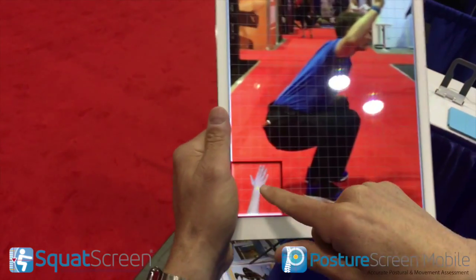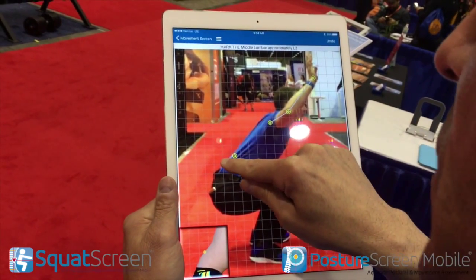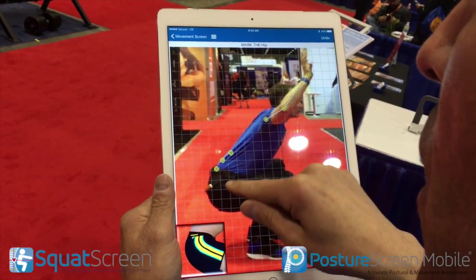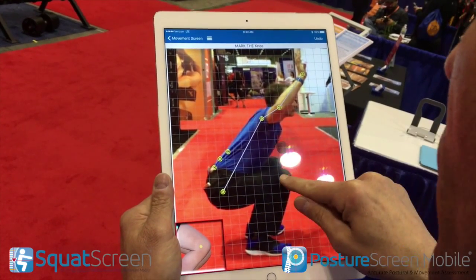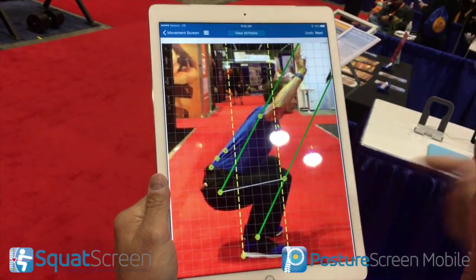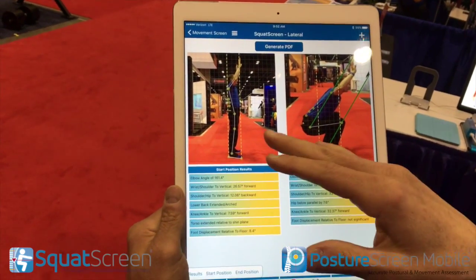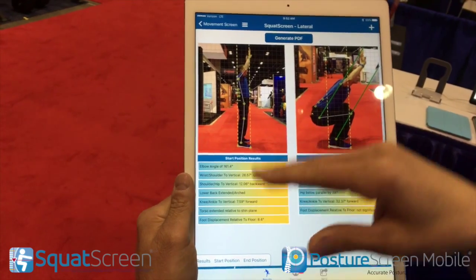What we do is digitize those known points, so we come in here. And obviously if this person was not at a trade show, we could do a quick analysis in shorts and have a much better understanding of their movement faults. As soon as we do that, we're able to get all the measurements.